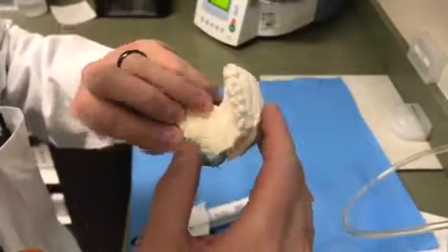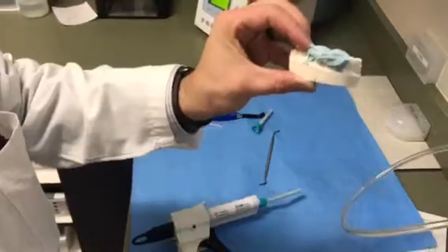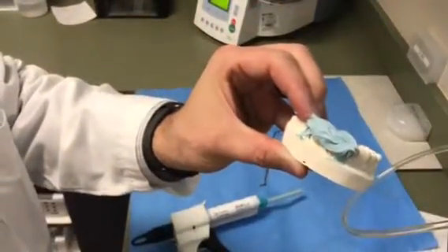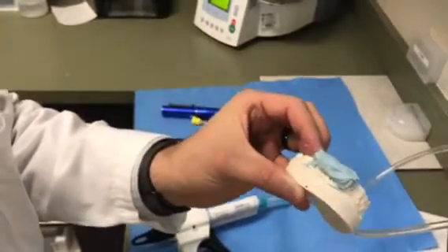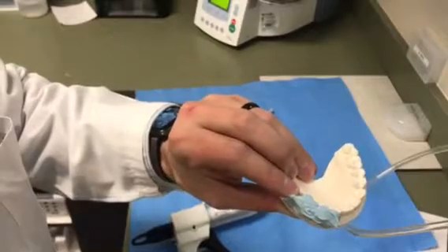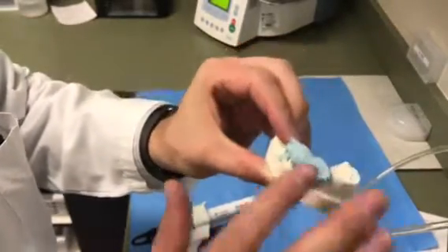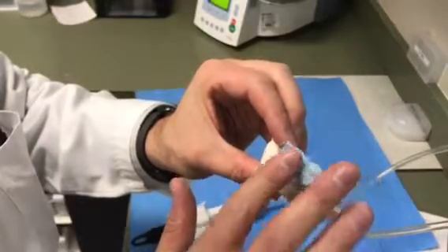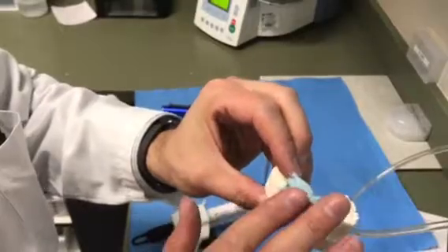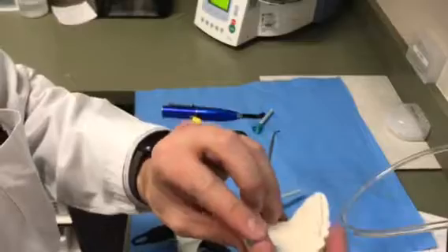And then you let that harden up. And I guess we'll have to wait just a few seconds till that hardens up so we can see it. So this method's all right. It's not amazing, but what I like is if it's more than just a contact that's open, it needs some contour change but not dramatic. This is a quick way that I can do it. So when I'm in a hurry, I can do it this way.